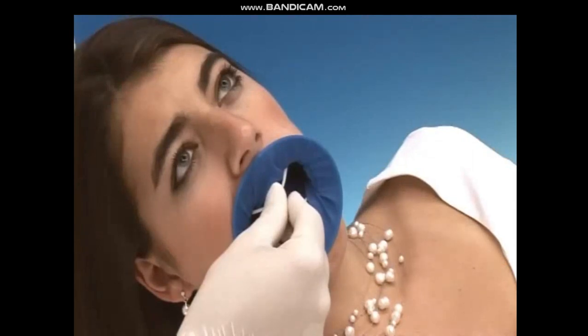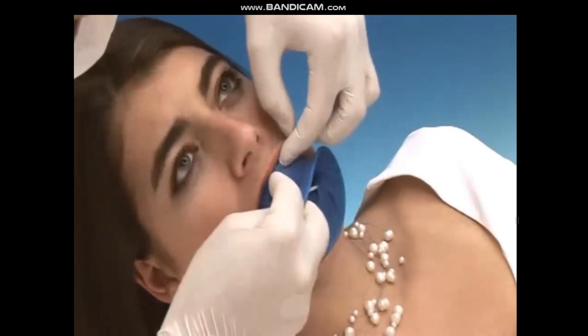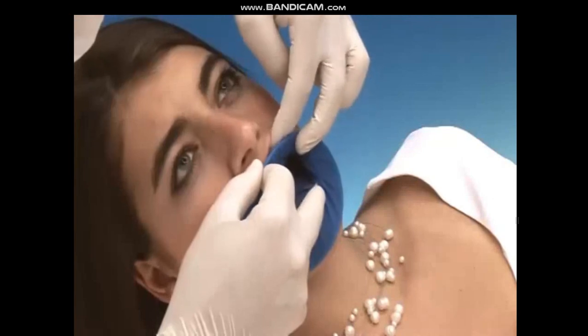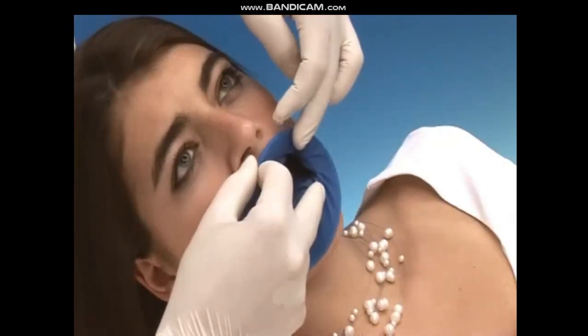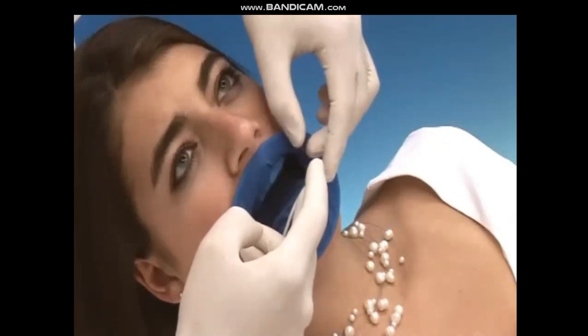In the third step, the intraoral ring is placed in the fold behind the upper lip. To achieve this, bring the extraoral ring to the level of the vermilion border and ask the patient to slightly close his or her mouth. In most cases, the intraoral ring will then slip into the fold by itself.